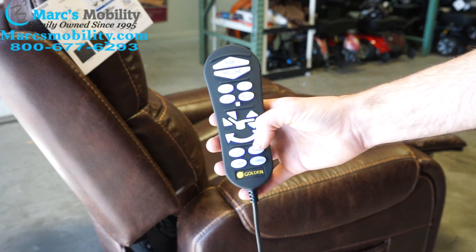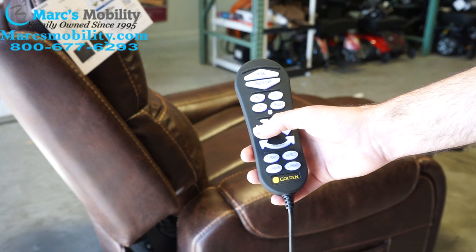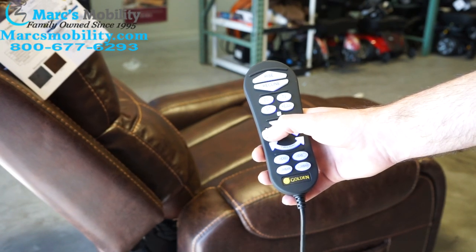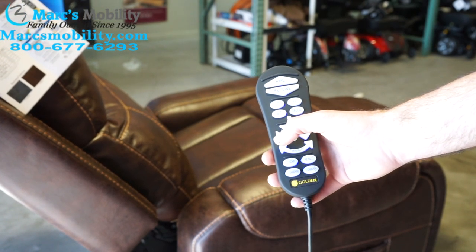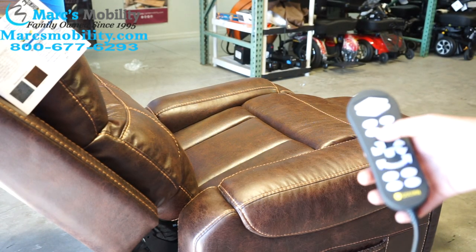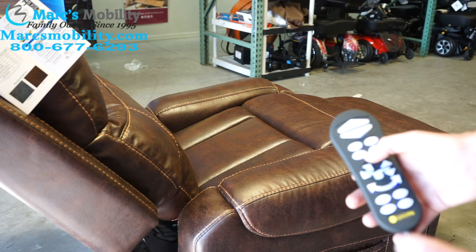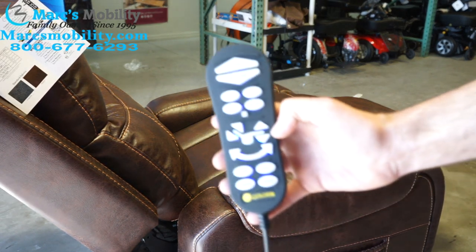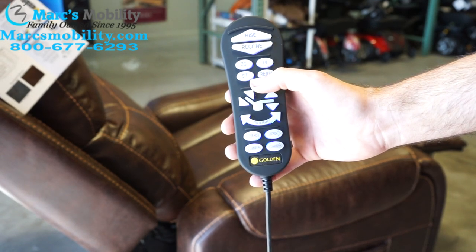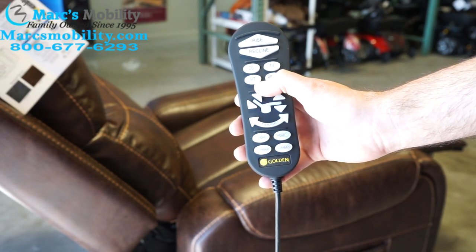So what you would do — if you want to set the TV position — let's say I want this back further. See how the recline is going back? Let's say I want this to be my TV position, not the one set from the factory. Once I get where I want to be, I'm going to hold the M button — you can see the little M button right there — and hold it until the joystick blinks.